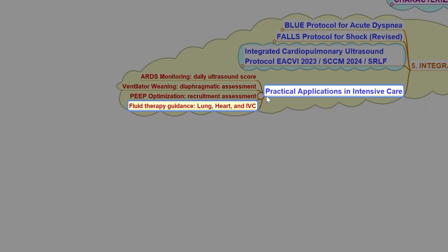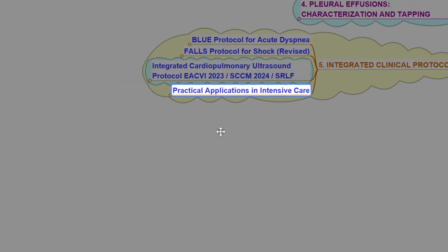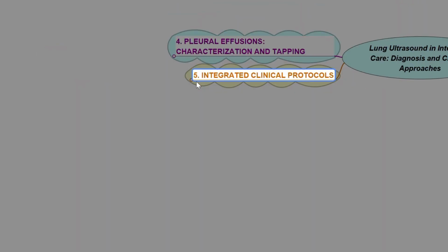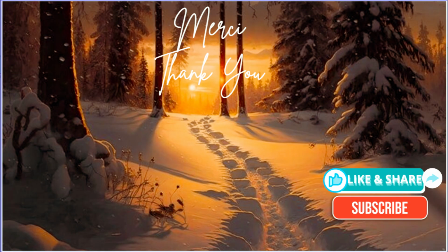So in conclusion, we should say that lung ultrasound offers a new perspective, combining the speed of imaging and the depth of clinical reasoning at the bedside of critically ill patients.